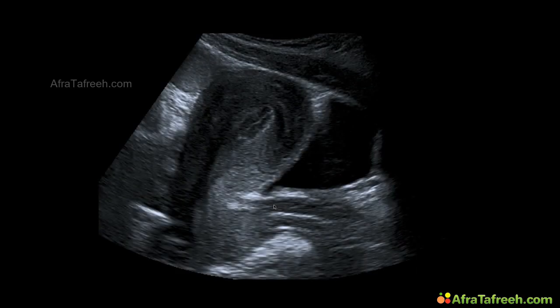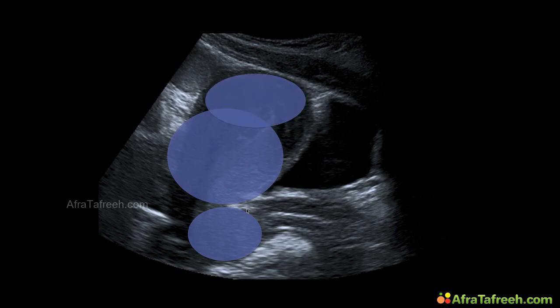In the longitudinal scan, we have to identify the regions of the uterus. So once again, we see cervix over here, body and fundus. We see the vagina in this region, and the same structures are seen in this abdomen ultrasound. Cervix of uterus, body and fundus, and very clearly to see over here the vagina, dorsal to the urinary bladder.